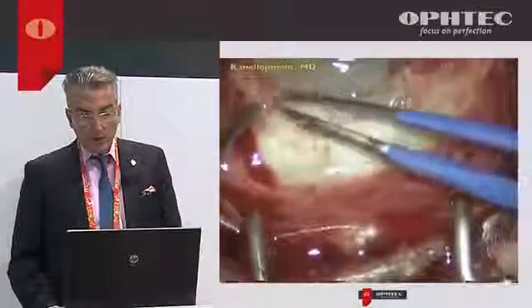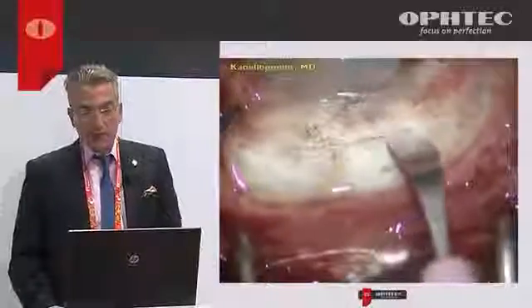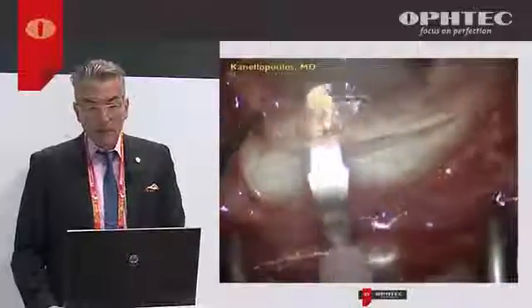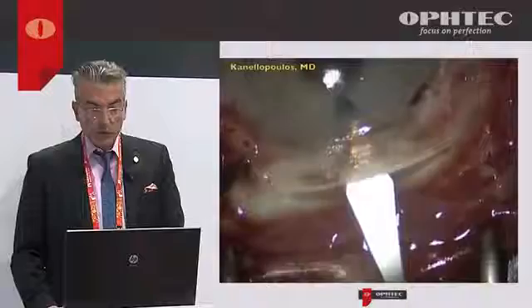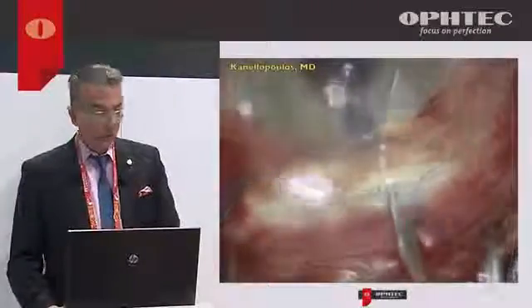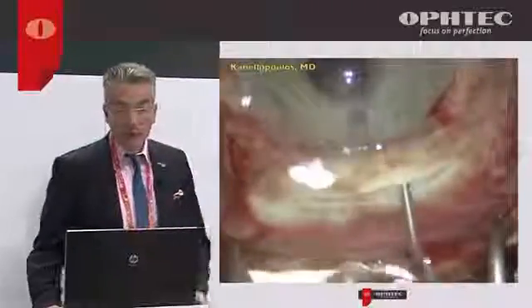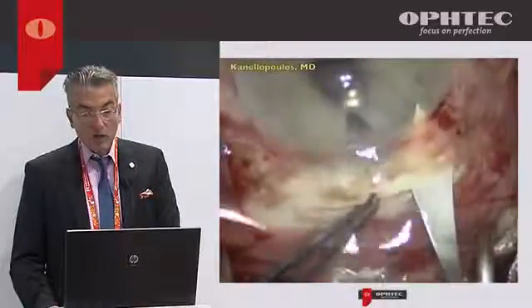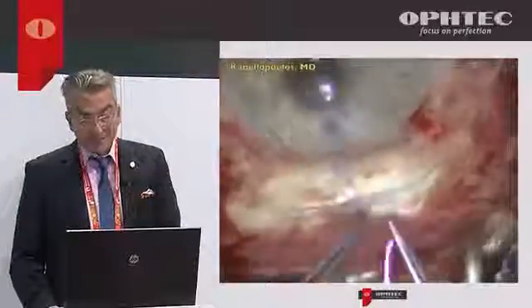Fortunately, the edema in the cornea is not dramatic, and because I'm also going to perform a glaucoma shunt, I prefer in this case to use a scleral tunnel. I'm using some of my old training in extracapsular surgery to create a long tunnel, which does not actually require suturing because it is going to be quite watertight. Remove the anterior chamber intraocular lens. This is the easiest case.